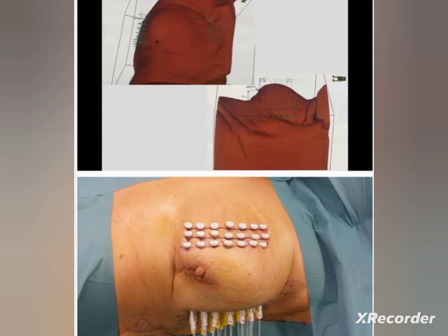This is the example of interstitial brachytherapy. Here we are implanting or inserting radioactive materials directly into the tumor. In this picture you can see different catheters we use in order to implant radioactive material, and it will be directly into the tumor. That's why the tumor size will be reduced immediately.